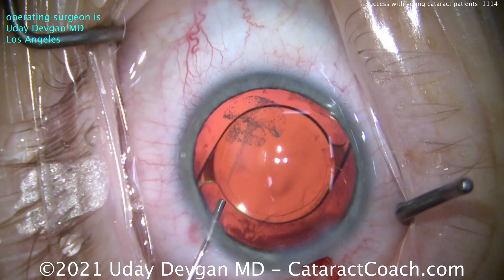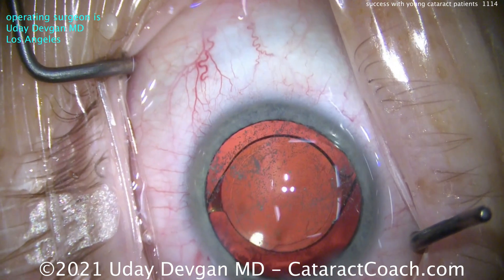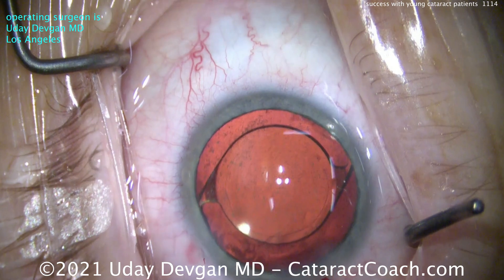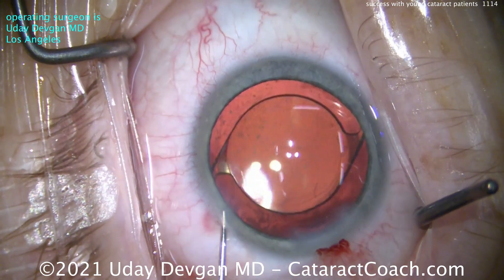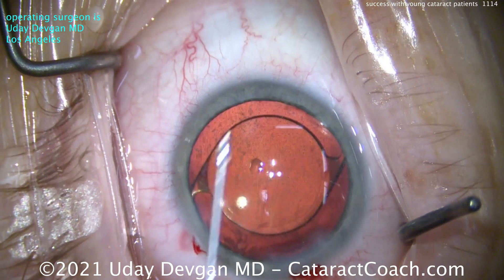At the end here, look what we're going to do — triamcinolone, preservative-free. A little bit of steroid there to help quell any post-op inflammation. We're going to put in a little bit more BSS, and then finally some preservative-free moxifloxacin. All of that goes into the anterior chamber as well, and that's going to help ensure we have a beautiful post-op outcome.